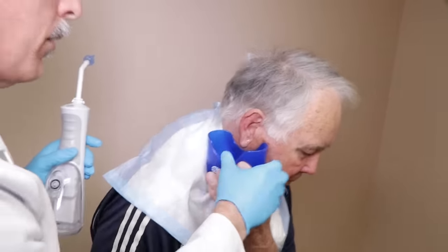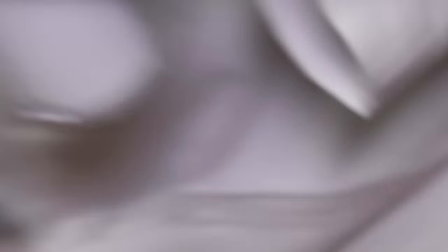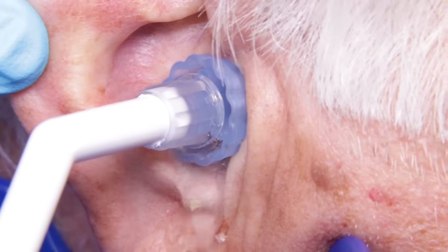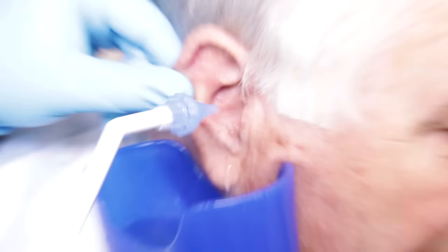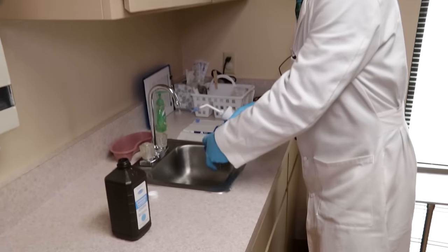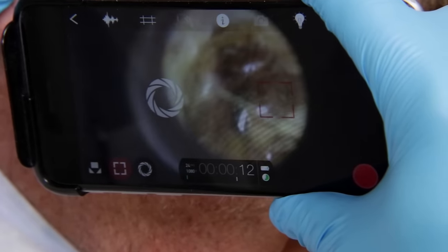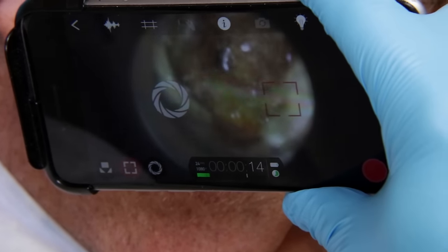So we did one bottle full. We'll do another one because we didn't get any wax at all — we're not even going to look, we're just going to get more. After two rounds of this, is it dripping? With just barely any material, we'll go ahead and take a look at where we're at. This is the right ear after two washings. It's moved things around a little bit, but it's not breaking loose yet. We'll do some more.